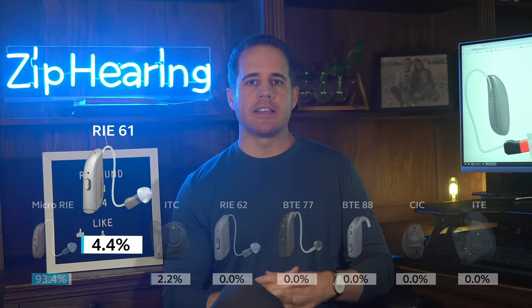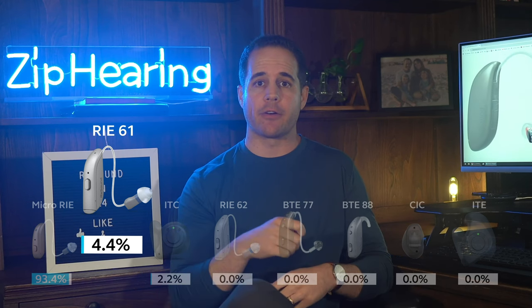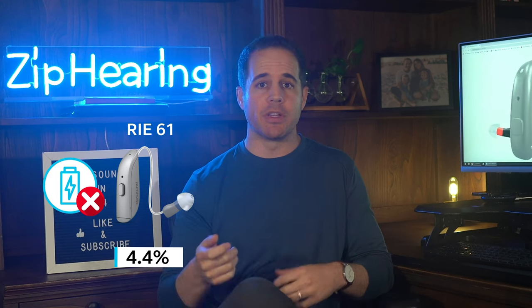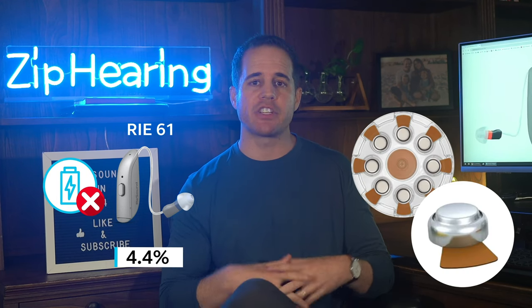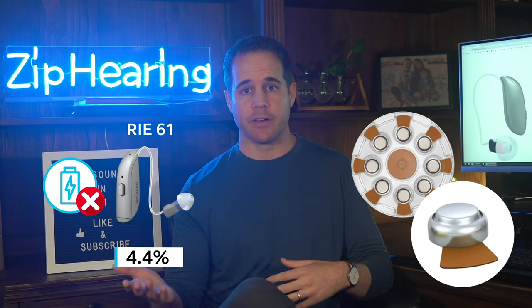The next most popular model is the RIE 61. It's a receiver-in-canal style hearing aid, just like the Micro RIE we just talked about, but this one's not rechargeable. It takes a size 312 battery that you have to change once a week or so, and most people just don't want to do that — hence the low popularity.